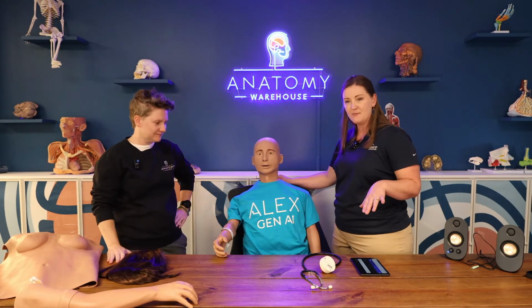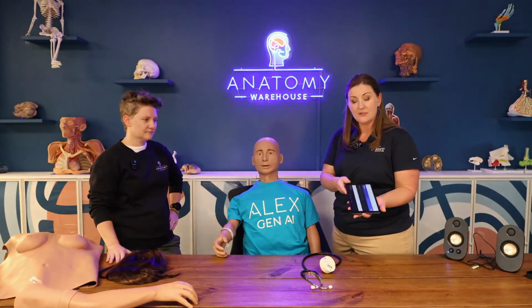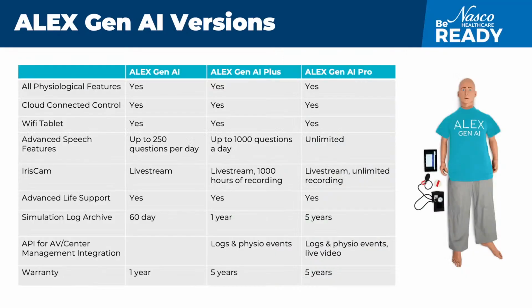Yeah, so the base mannequin comes with all very standard items, a very standard 10-inch Android tablet, also an auscultation smart scope. So the smart scope is specific to heart, lung, and bowel sounds. He also has a blood pressure cuff that is specific to the mannequin as well. So those are the very simplistic and basic things that are included with him.